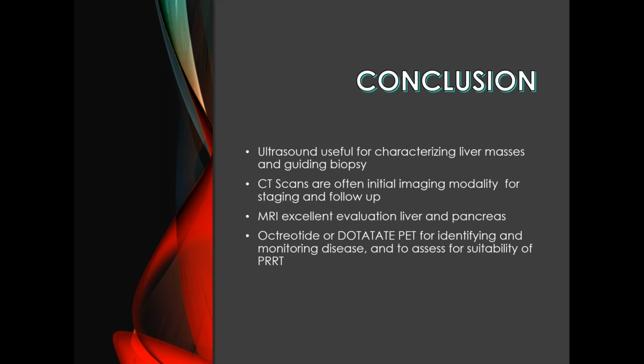Yeah, exactly. And so if it's not seen on DOTA-TATE and it's not seen on anything else, then you might consider the other rare PET things. I mean, really, it's only F18 DOPA that we have access to here in Canada, and that's a research study in Edmonton. But you have to start thinking about, should we go into other PET, or do we just serially follow up and see if we can see anything with time, like every 6 months, for example. So really important discussion between you and your clinician.